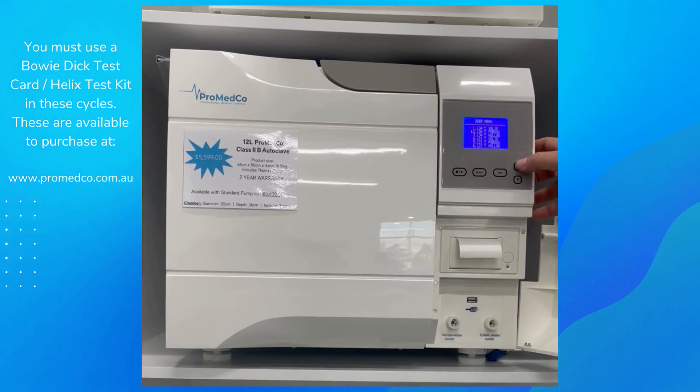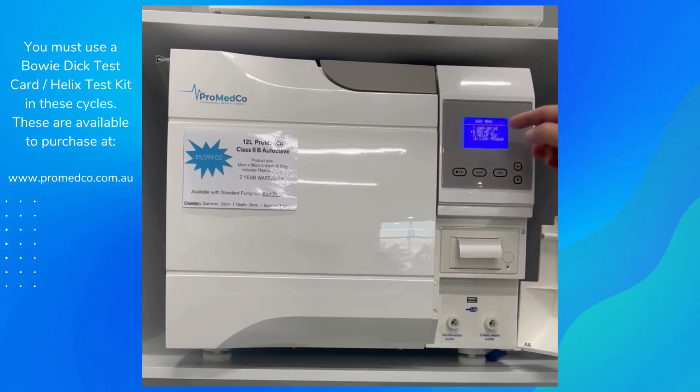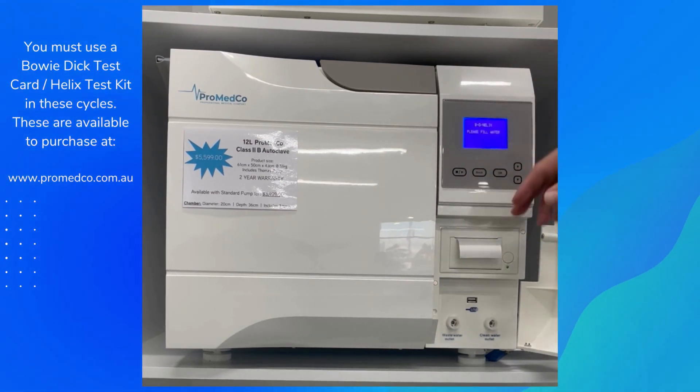Make sure you run a vacuum first and then the Helix. We can go down but I tend to go up for speed. Use the menu, go back up, and on number eight it's the B&D Helix. Press Start — disregard the 'please fill with water' message as the water isn't connected.